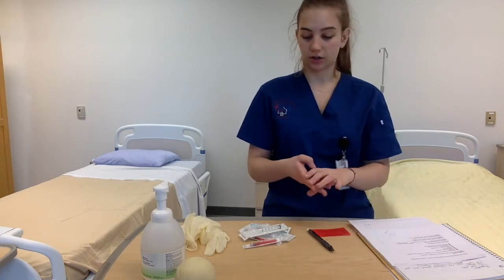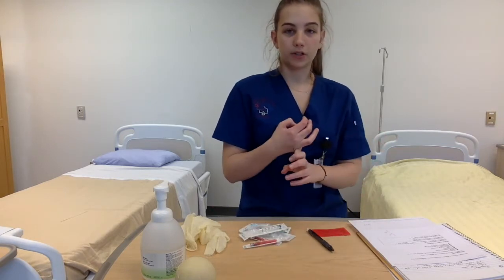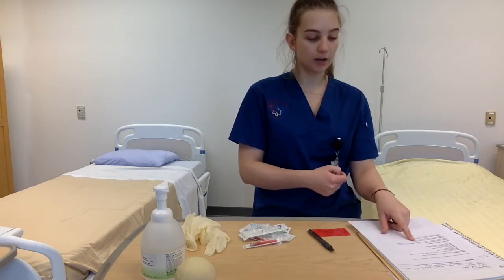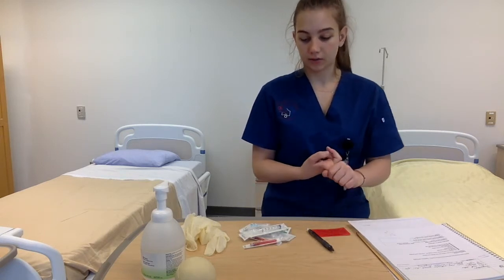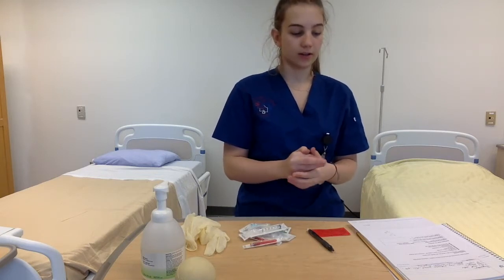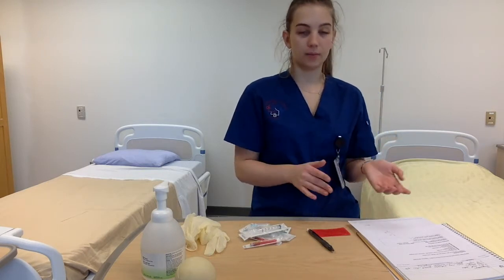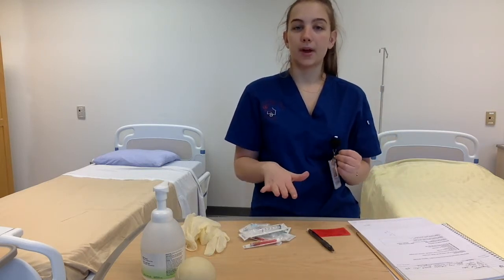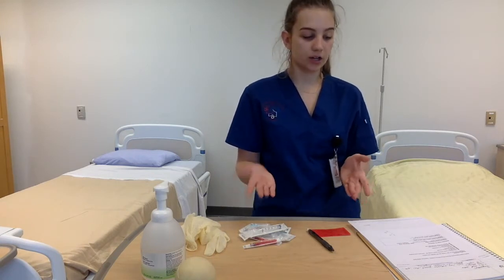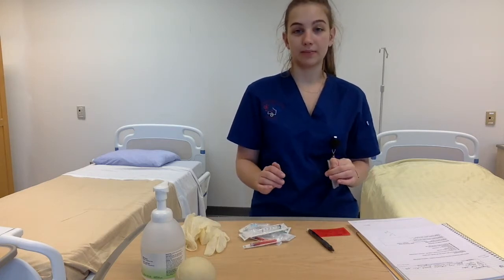We also need to make sure that we're using the right medications, which I'm getting set up here. We want to make sure we're having the right dose, so I'm checking that on the medication administration record, the right site. So we want to make sure that we're giving the needles in the right site on the body, and we also want to make sure that we do the right documentation after the medications are given, as well as checking the documentation before we give the medications. And lastly, we want to make sure that we give them at the right frequency.